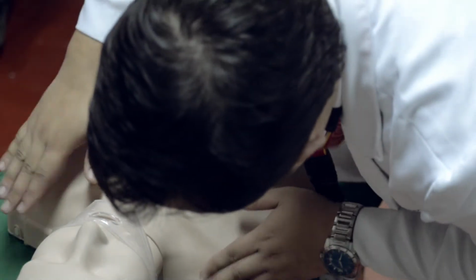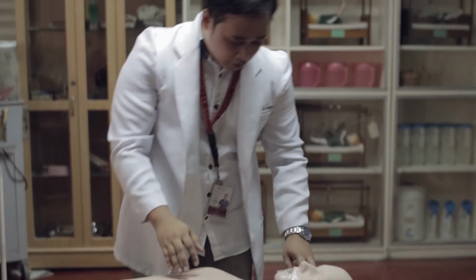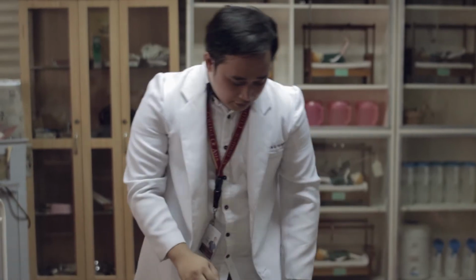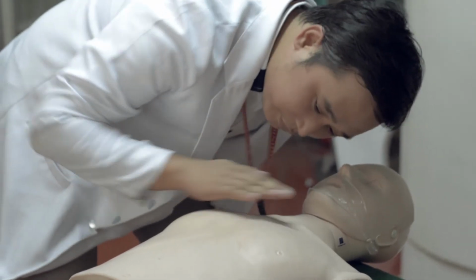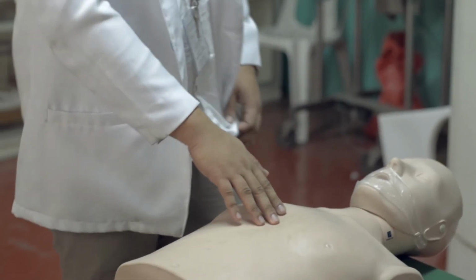The scene is safe. Stand back, please. I am a certified BLS provider. My name is Nico. Please give room for the patient. Please sir, are you okay? Please sir, are you alright? The patient is unconscious and is not responding. Check for the breathing status. The patient is not breathing. Activate EMS and get an AED.